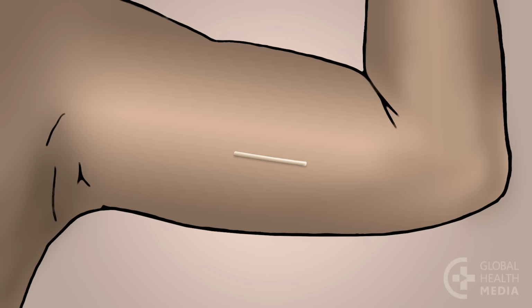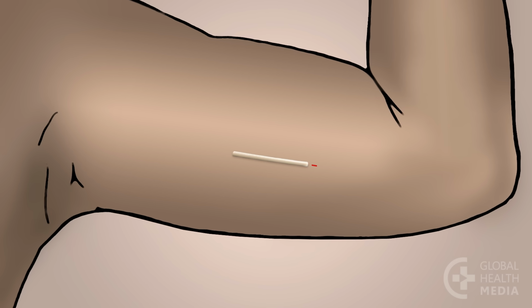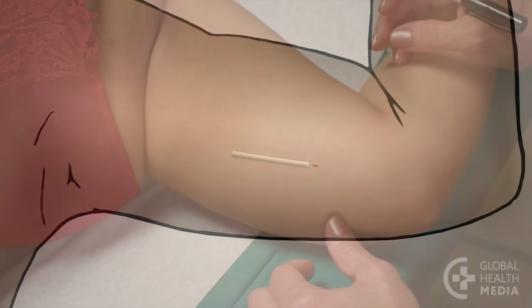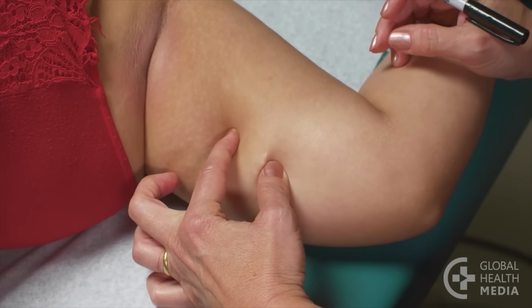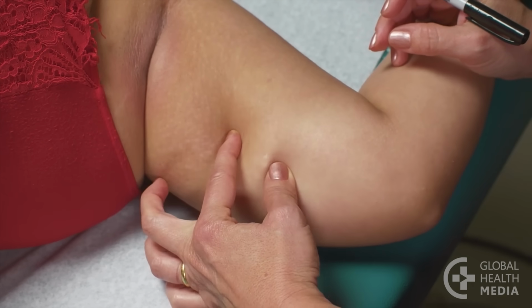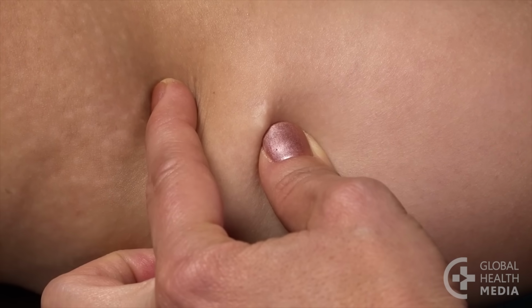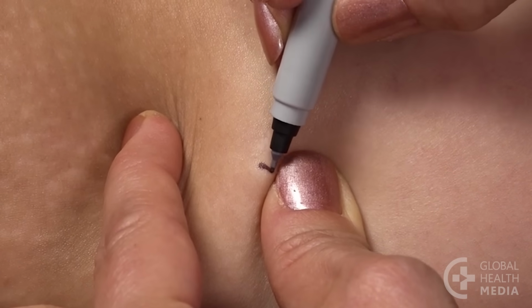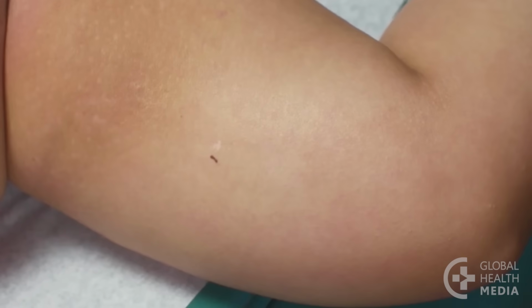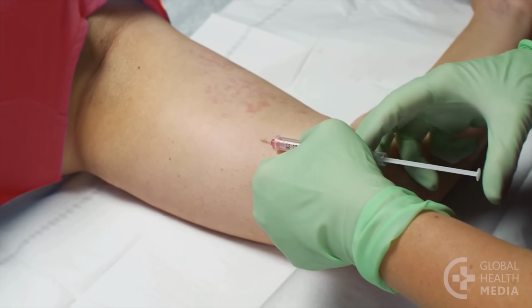Now, here is how to remove a 1-rod implant with a longitudinal incision. Press on the far end of the rod to make the close end bulge into the skin. This is where you will make the incision. Make a line on the skin right on the bulge of the tip. Give a small amount of anesthetic under the end of the rod.